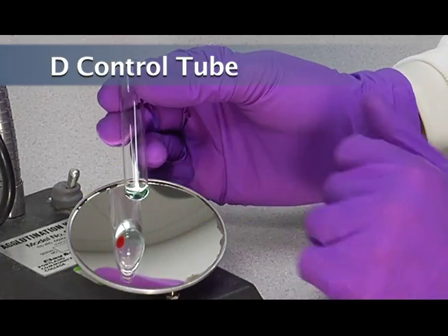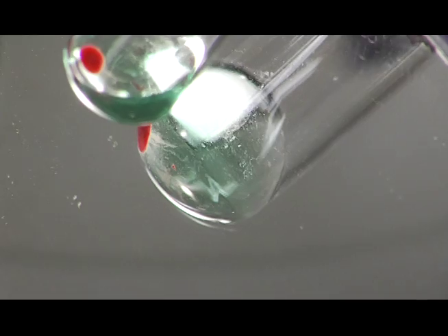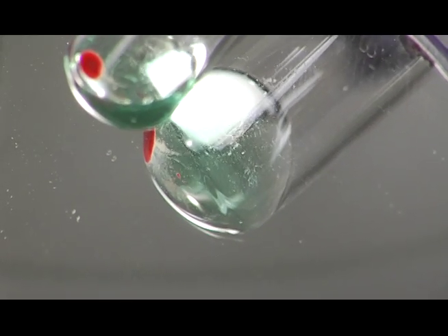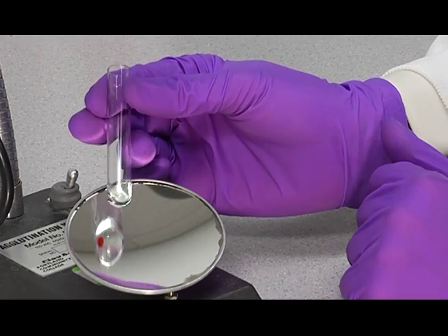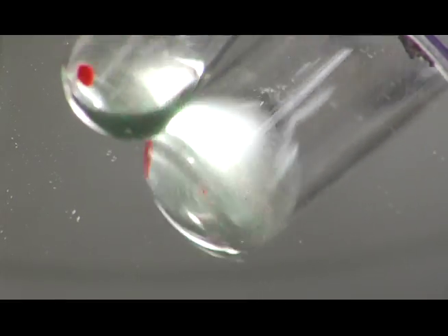And then we'll read the control tube as well. And tap that reaction off. You can see the check cells lifting off.